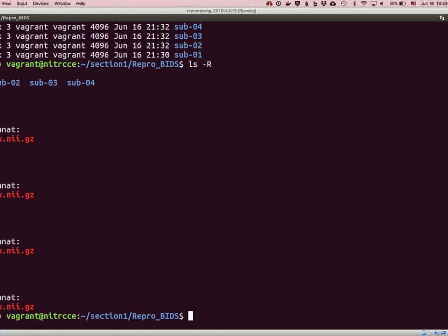And there are automated tools for creating all this data structure, which will be talked about later. Yark and others will talk about ReproIn and a number of other ways to automatically do these conversions. But again, you do it manually first. Exactly.